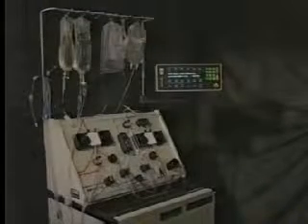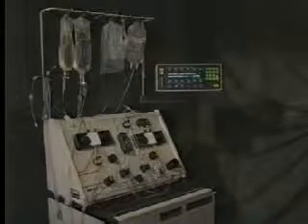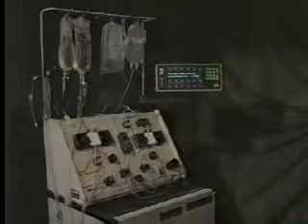You may notice that the valves change position and the pumps change flow rates as the Spectra system goes through the priming process. The display shows various messages to inform you of the progress of the prime. The priming process proceeds automatically, taking about 5 minutes to complete. Wait until the system instructs you to prime access and return connections and the Spectratherm line.